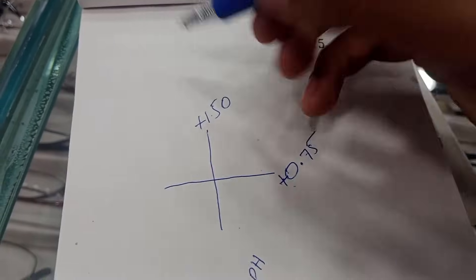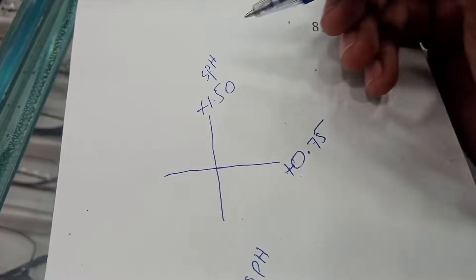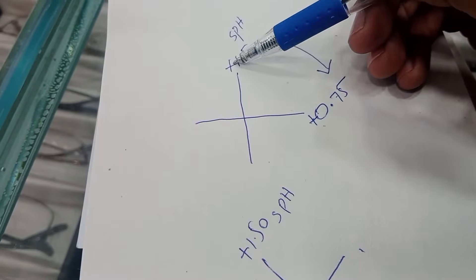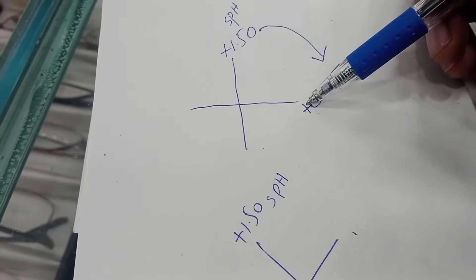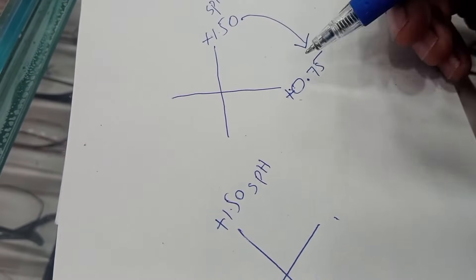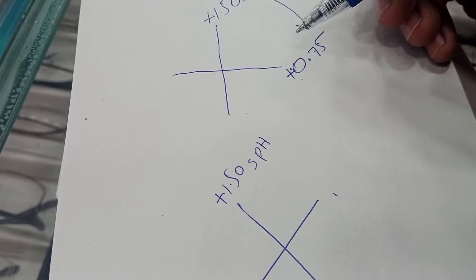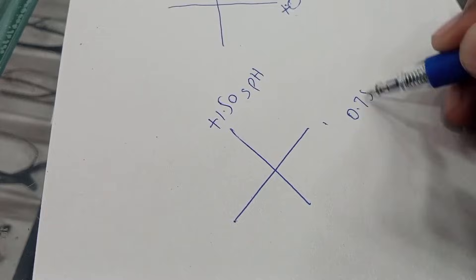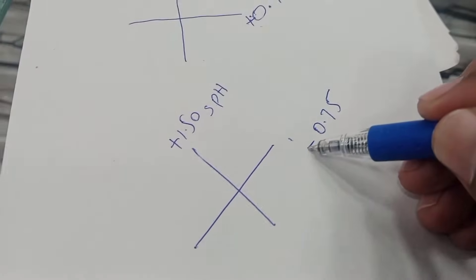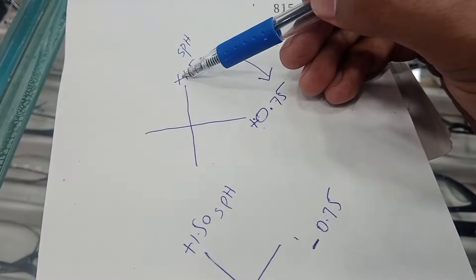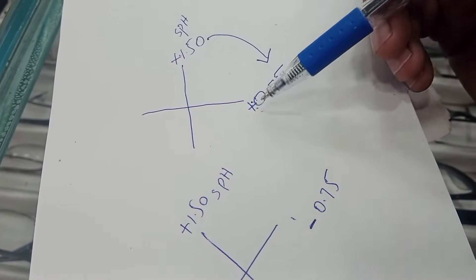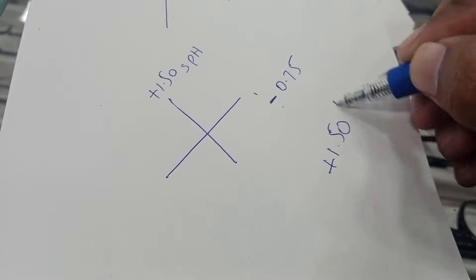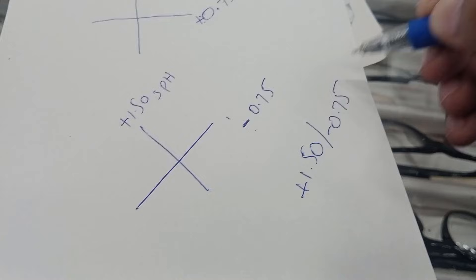So we can take this as spherical. Now the meridian is clear at plus 0.75, and to have the cylinder we will move from plus 1.5 to 0.75. The difference between these two will be cylinder. So plus 1.5 is sphere and 0.75 will be cylinder. What about the sign? It would be minus because we are moving from greater plus to lower plus. We are actually moving towards the minus direction. So the final prescription would be plus 1.5 with minus 0.75 cylinder.